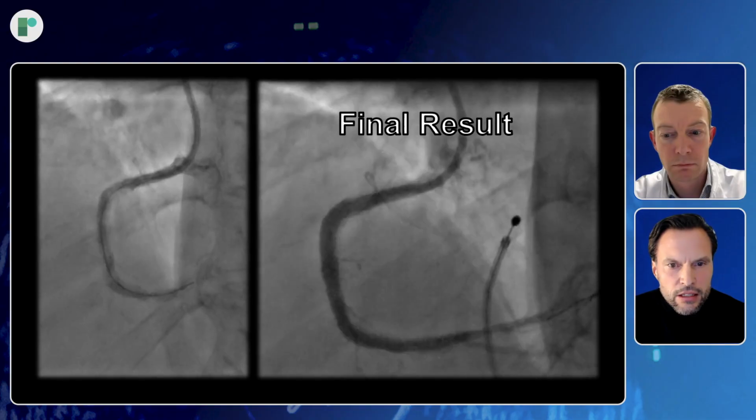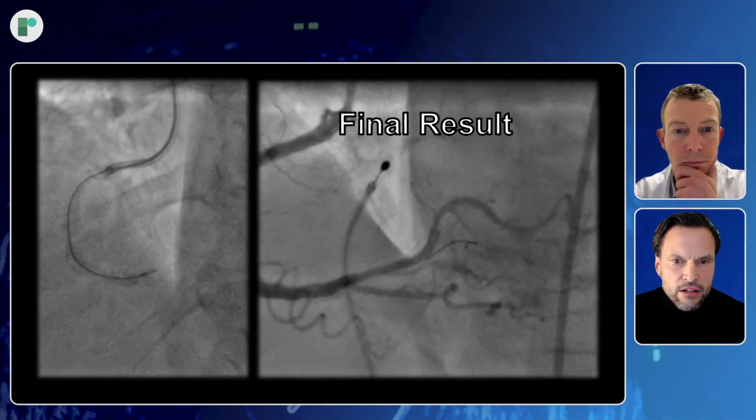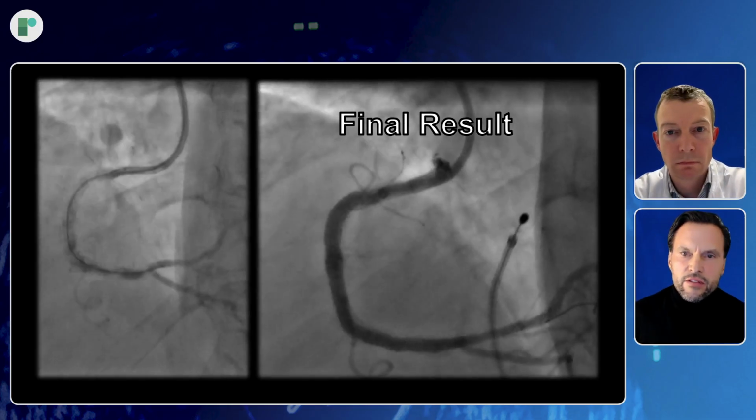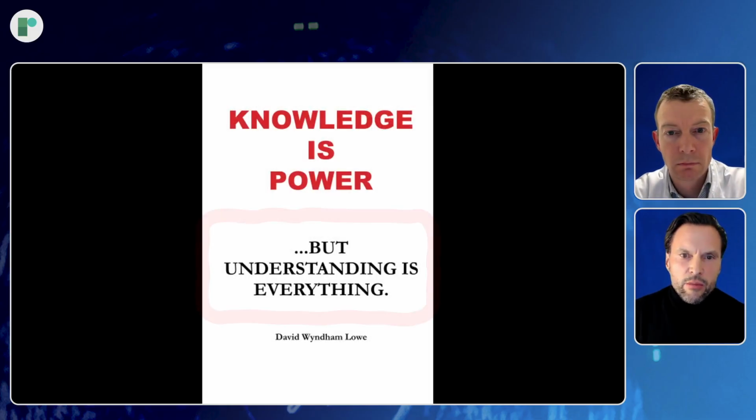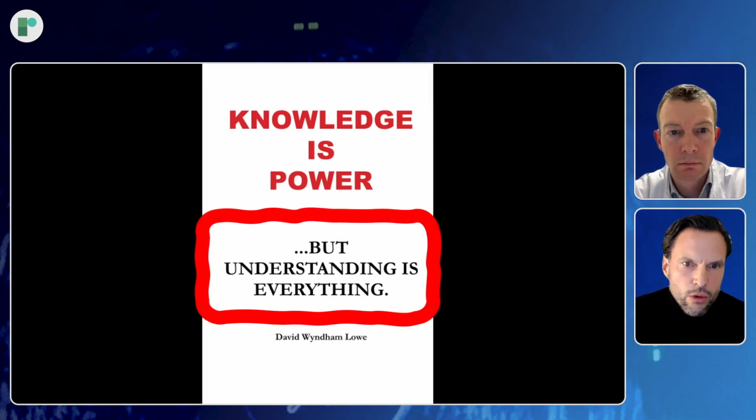So to use those tools well in every patient and to decide what to use, we must have this information available. It's important to really know what is going on there. For a good treatment, to decide what is best in every case, it's really important to understand the disease, and thereby it's extremely helpful to have all the information available from intravascular imaging.